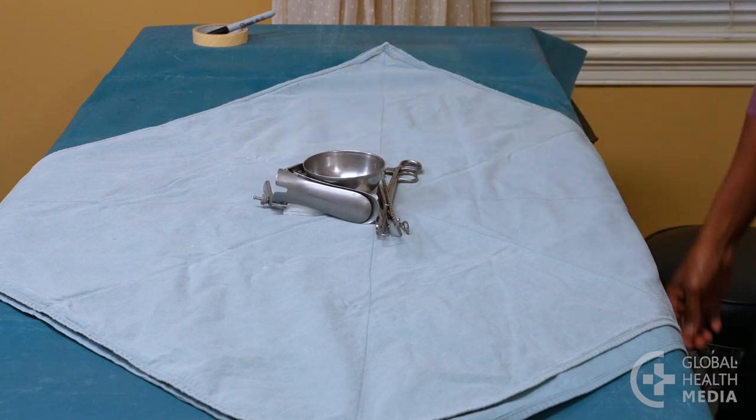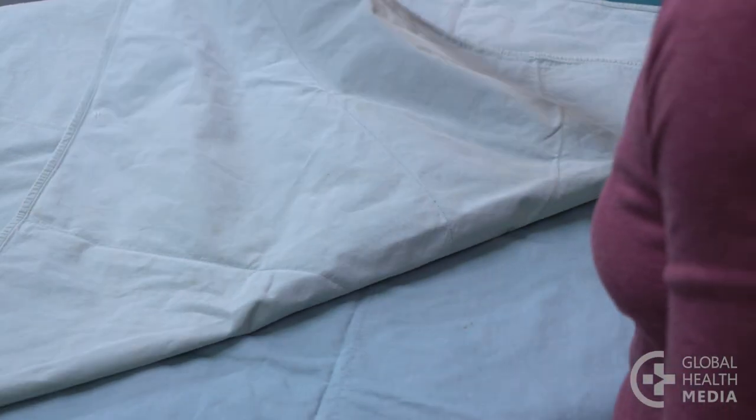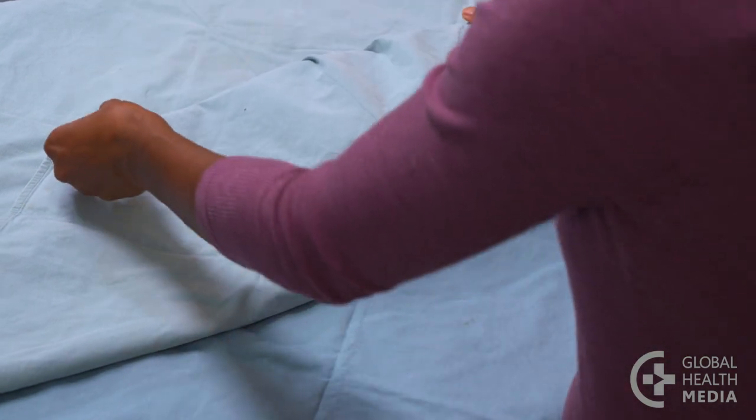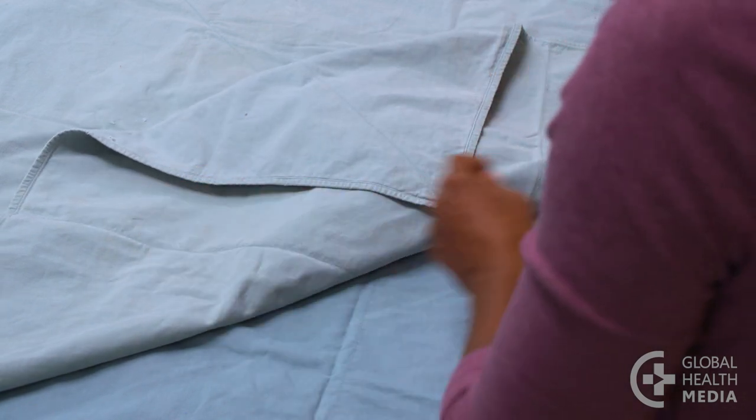Begin folding by bringing up the lower corner of the wrap to cover the contents. Fold the tip back on itself to form a tab. This is used later to help open the pack in a sterile way.